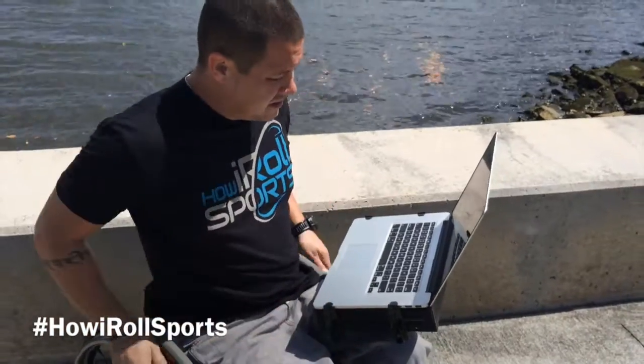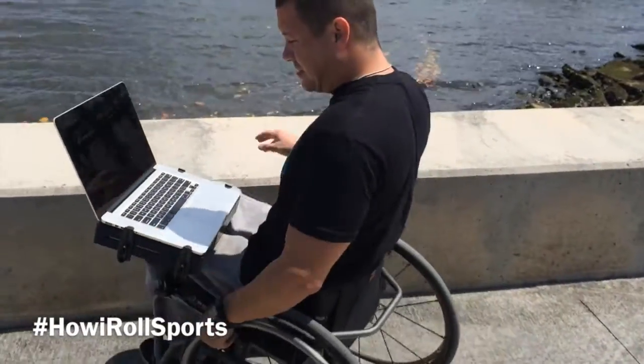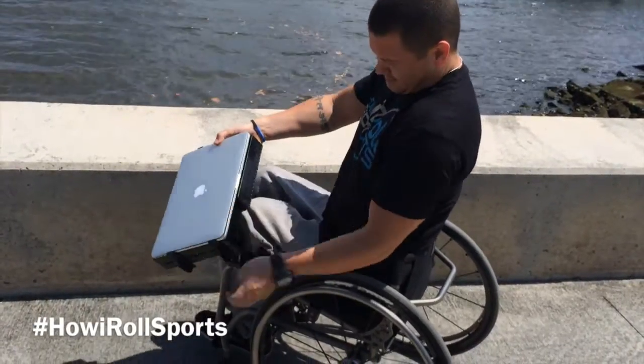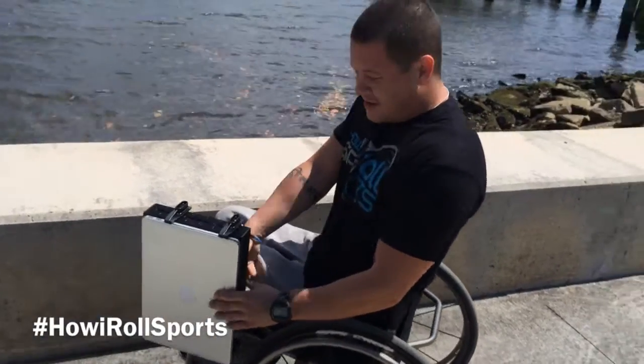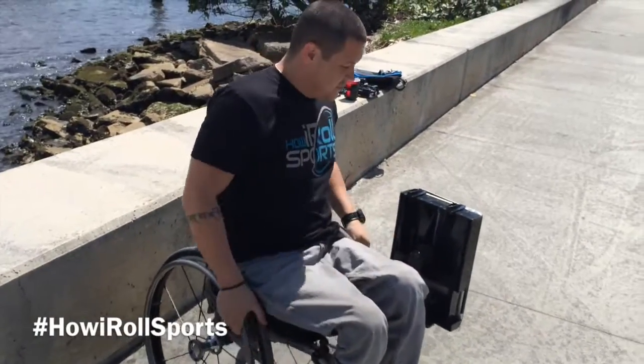Voila, laptop mount. Sturdy — you can hop up and down curbs with this, you can do whatever you like. Fantastic. You can put it on the other side, put it down if you need a transfer. Lay it to the side, get your transfer on, do whatever you need to do.